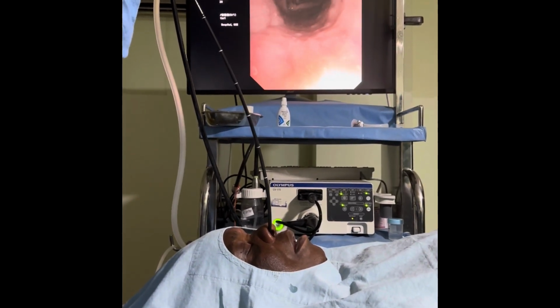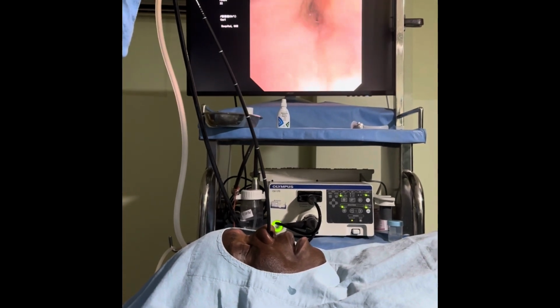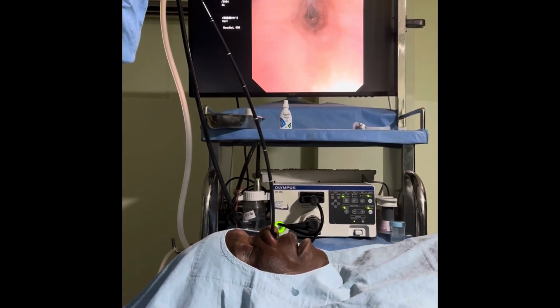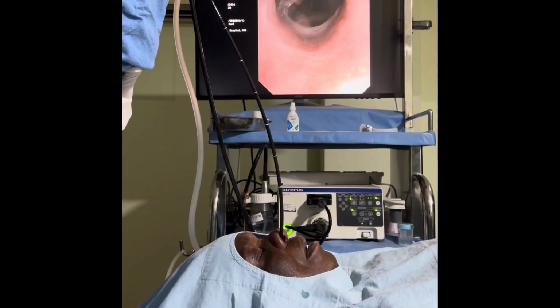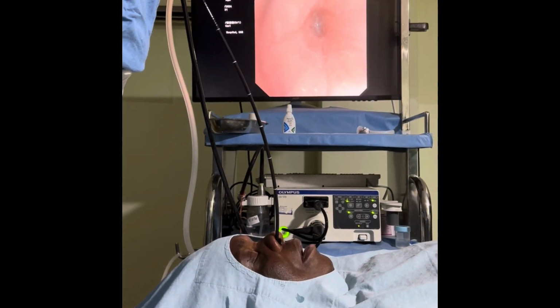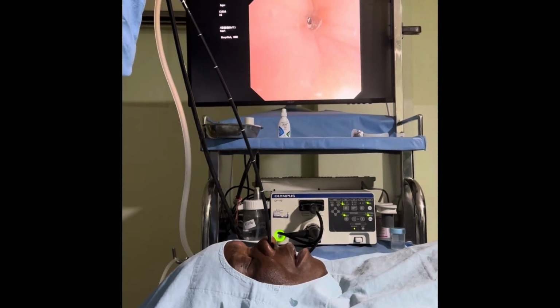We are having a bird's eye view of the airway. We are checking that yes, there is no collapse in this area. We can see the epiglottis is open. You can see the lingual tonsils are far away. They are not pushing or collapsing. So this is that area of the bottleneck.